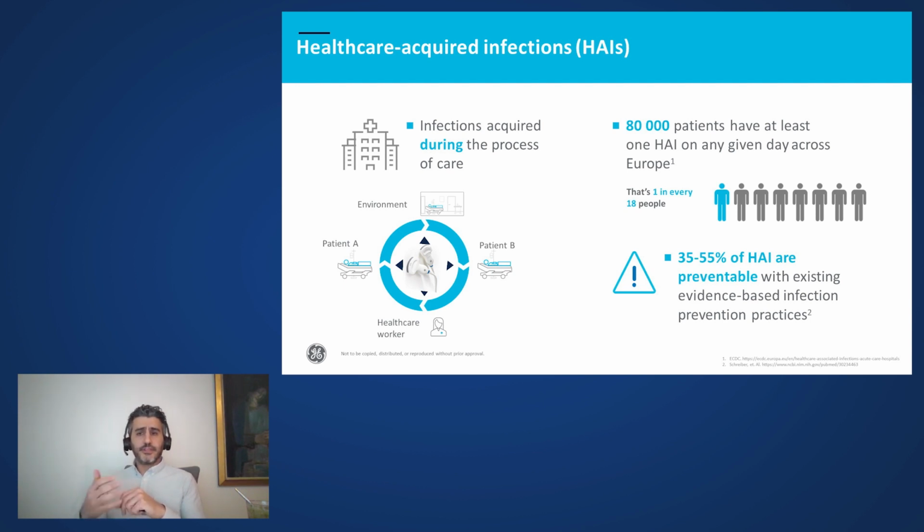Could be patients with a reduced immune system with a way for germs to enter the body. So let's say you've just gone through a surgical procedure where your skin is broken, and then you need to do an ultrasound examination. In this way, you might introduce germs into the body of the susceptible person.